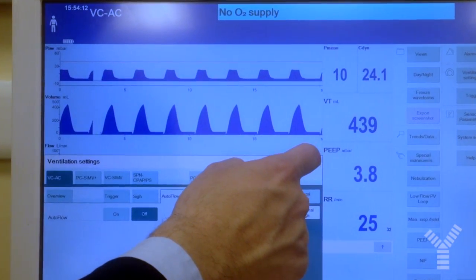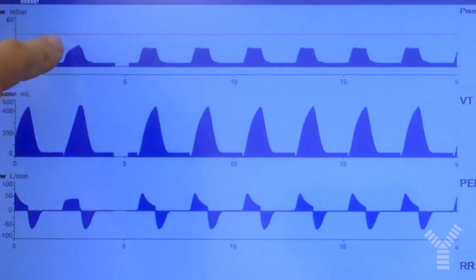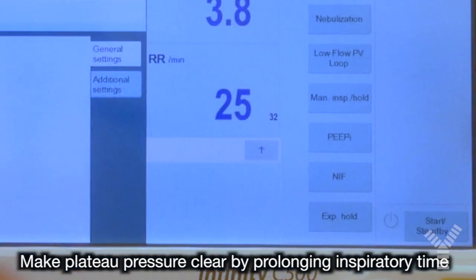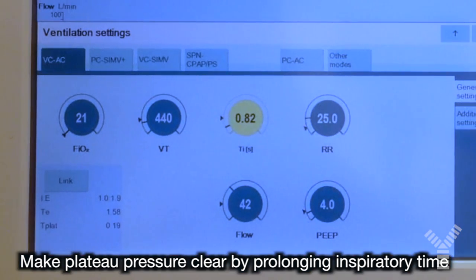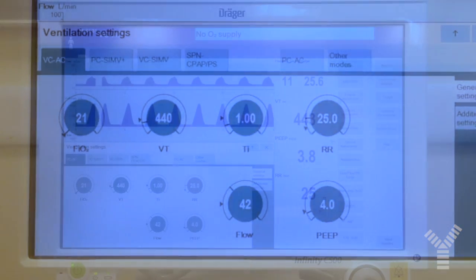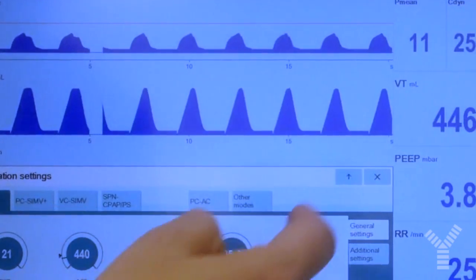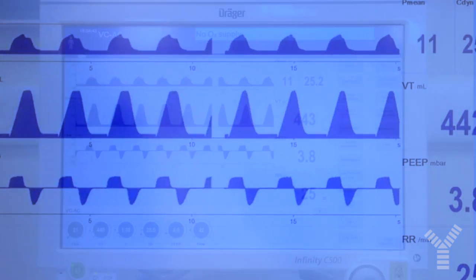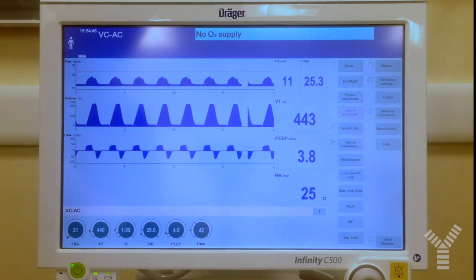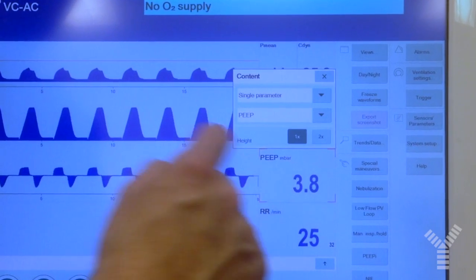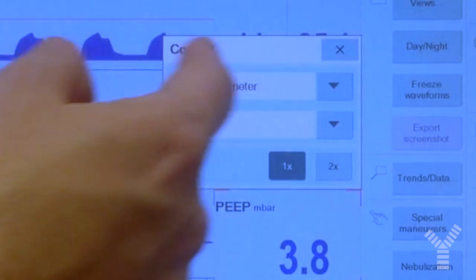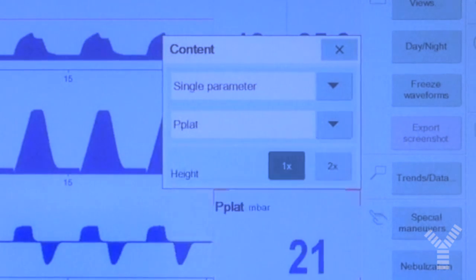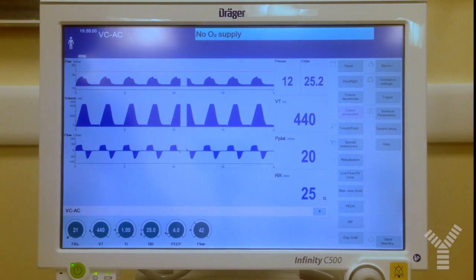At this point we have a peak but plateau pressure is not very clear, so what we do is slightly prolong the inspiratory time. By doing this, plateau pressure is now evident and we still have no gas trapping. We then achieve continuous display of plateau pressure by pushing the PEEP button and switching to plateau pressure, and the ventilator will display it continuously.